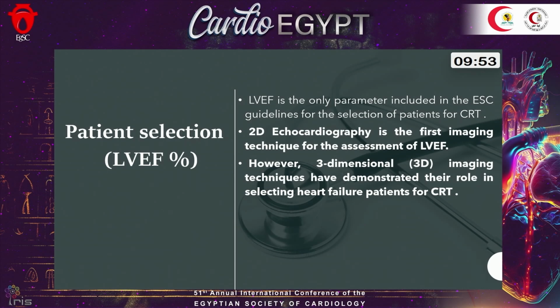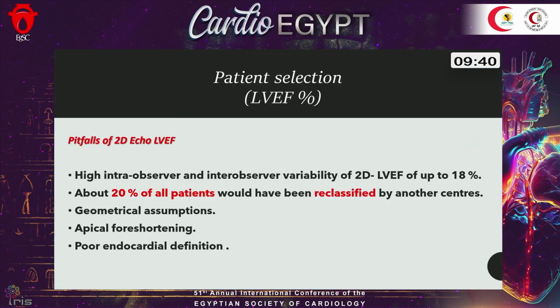But 2D echocardiography is the first imaging modality. However, three-dimensional imaging techniques have demonstrated their role in selecting heart failure patients for CRT. What about the pitfalls of 2D echo?